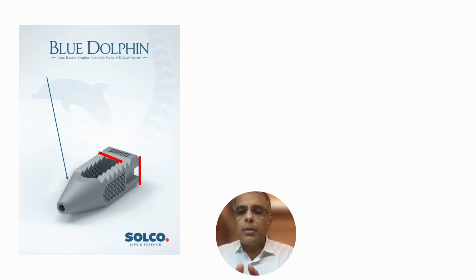I'll show you in the next image how it is happening, but please bear in mind that you always insert your cage at its width, not at its height. Width will remain the same while the height will start from 8 millimeter and go up to 14 millimeter. So far, I guess Solco has made a 30 mm cage as a fixed length, but I think we are in the process of designing 25 and 35 also for smaller and bigger patients.